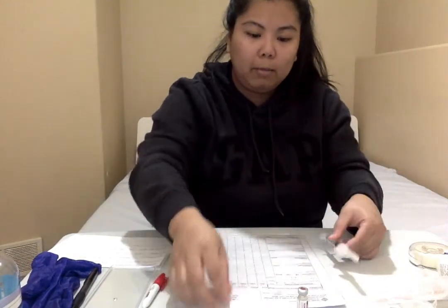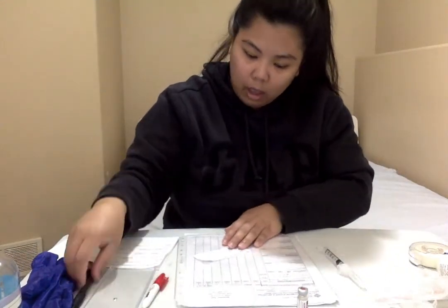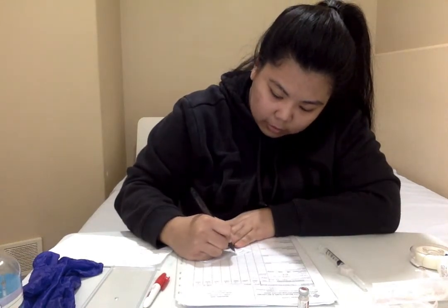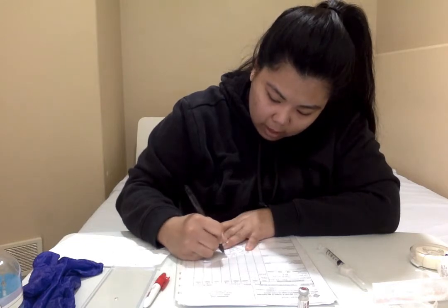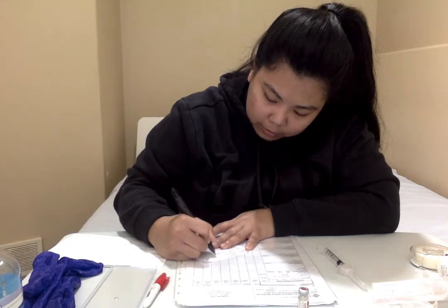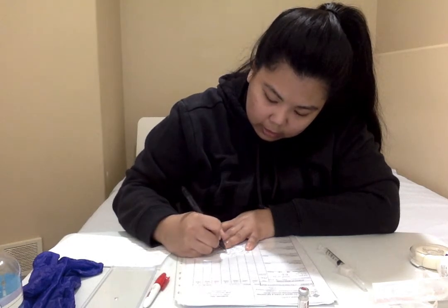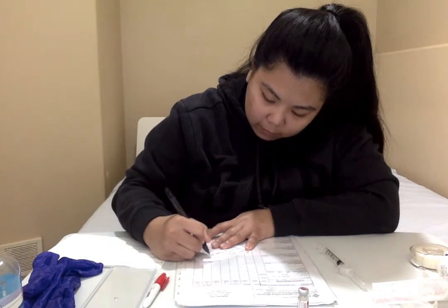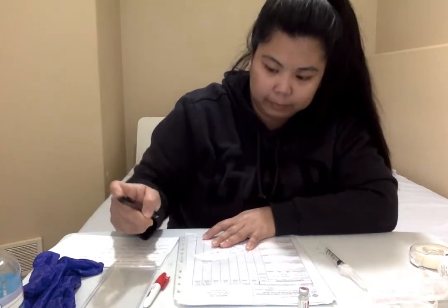And then we want to make a label right away. So the drug's name is heparin. The dose is 5,000 units. Volume is 0.5 ml. Concentration is 5,000 units per 0.5 ml. Today's date is March 10, 2022, and the time is 08:15 hours, and my signature.